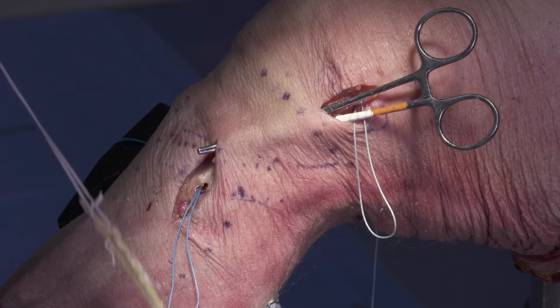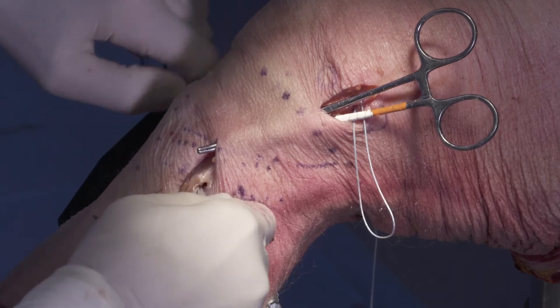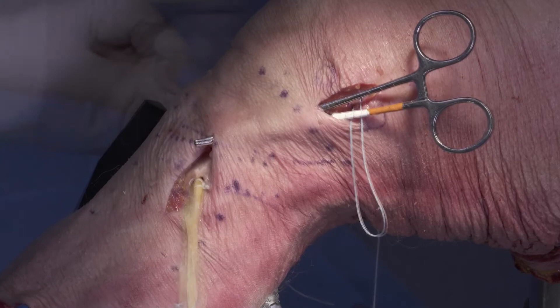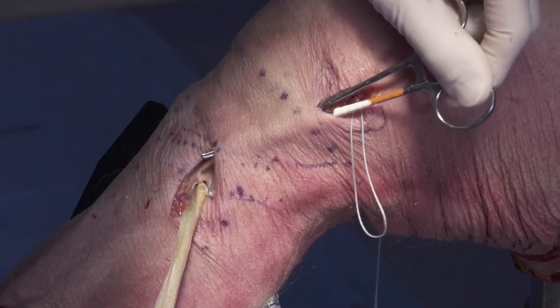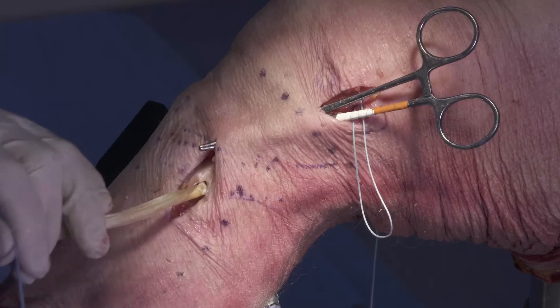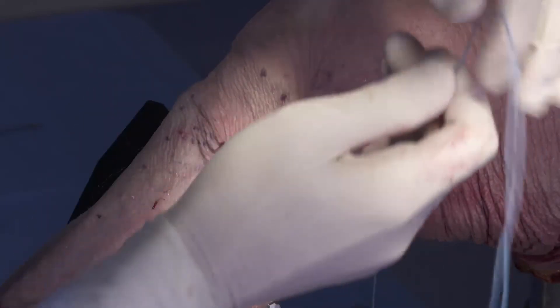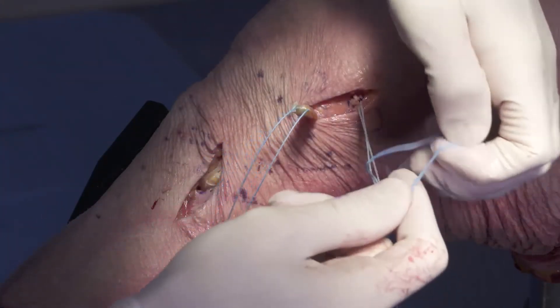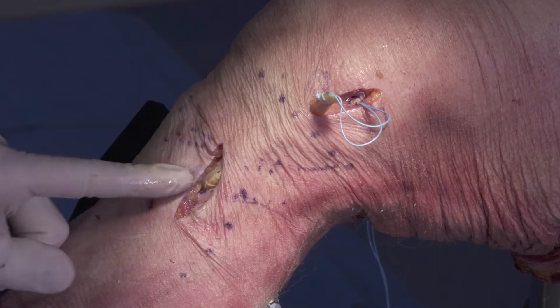We now have our graft, which was previously prepped. We're going to first dock it into our tibial tunnel using our passing suture. We've bottomed out the graft here — I like to put a snap on the backside of the skin just to hold that tension in the tunnel. I've already used a hemostat to make a pass under layer one of the medial aspect of the knee, and I'm going to use that to shuttle my graft towards my femoral tunnel. Then lastly, we can dock the femoral side through this tag stitch. I'm not going to pull this all the way in yet because I'm going to wait until I get my fixation in the tibial side first.